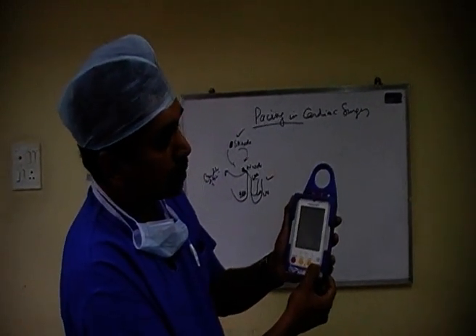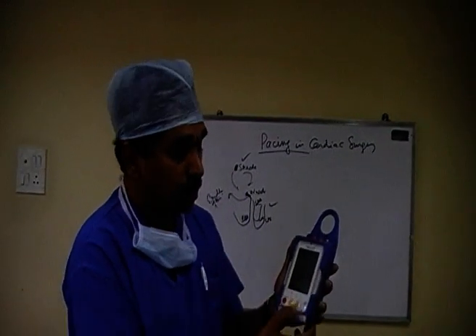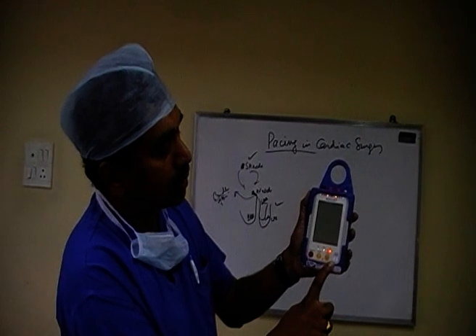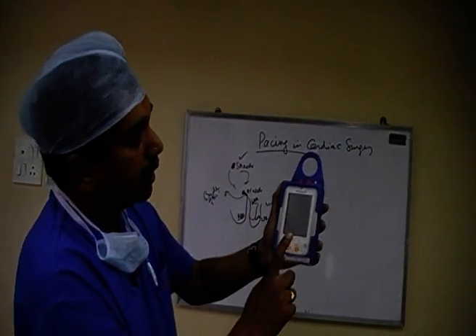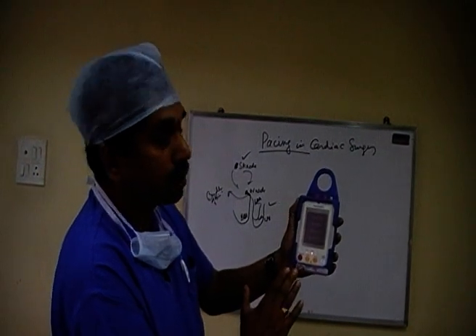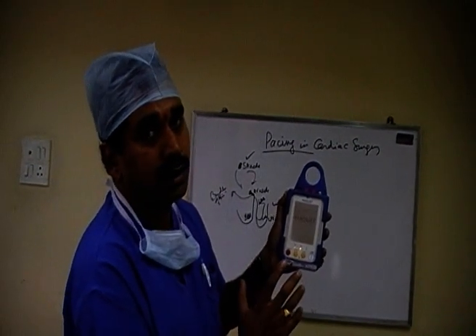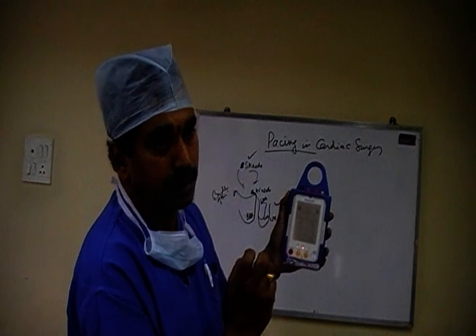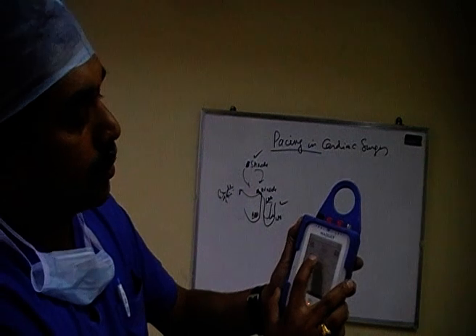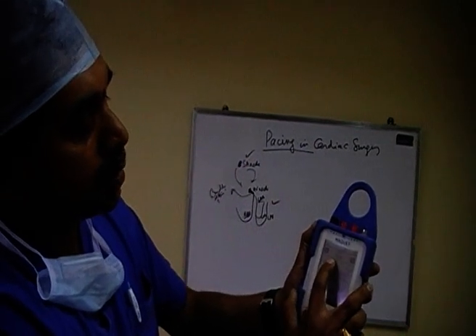And in this pacing box, and in any pacing box, you need to know how to switch it on. So usually the normal standby or switch on button will be there. When you switch it on, the pacing box switches on and it has a default mechanism built in. So in this, the mechanism that is there, it says ODO.